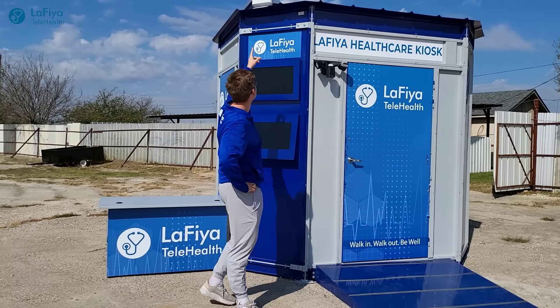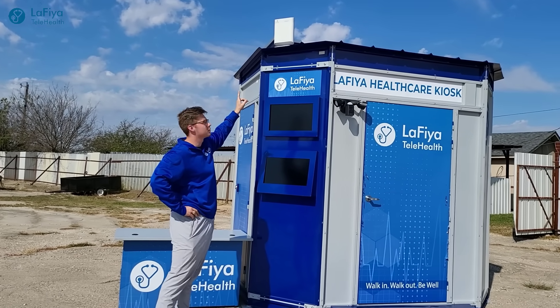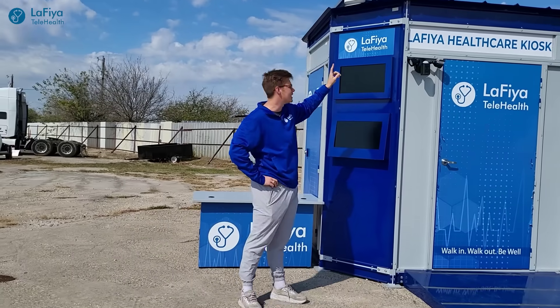Up top here, this kiosk is powered with an Orbe. This is going to provide Wi-Fi to anybody around the kiosk or outside the kiosk if needed.